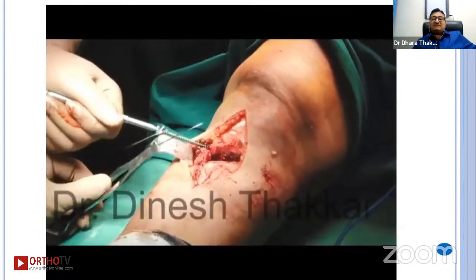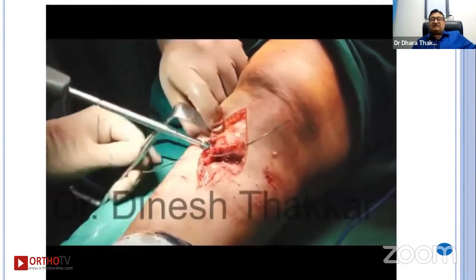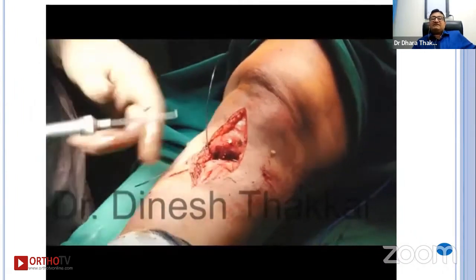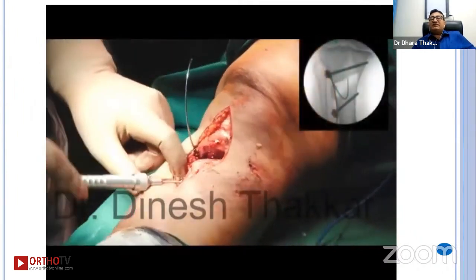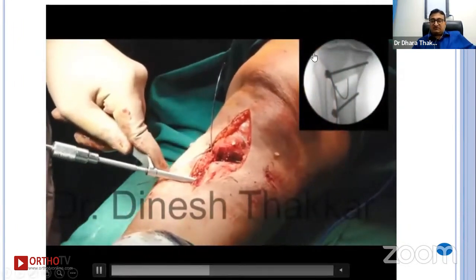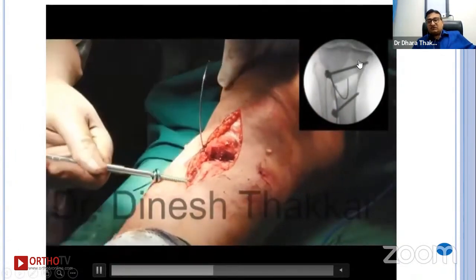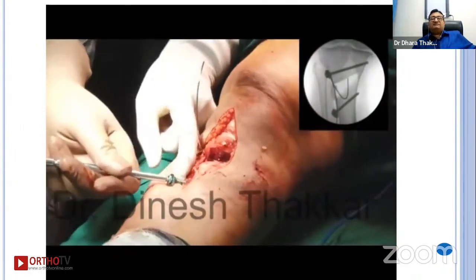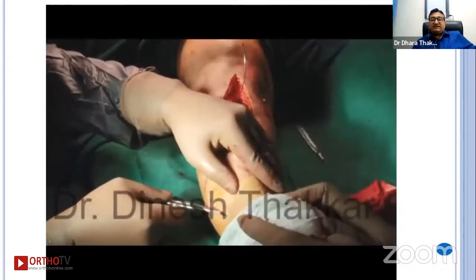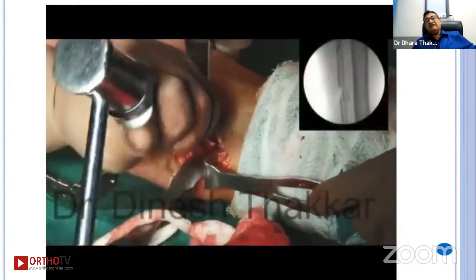Then one screw is passed in the proximal fragment with an SS wire, and another in the distal fragment. Previously, I was placing it parallel to the osteotomy, but now I am passing this screw juxta-articular. This is the distal screw being passed. After doing this, I have still not cut the posterior cortex. The posterior cortex is still intact.